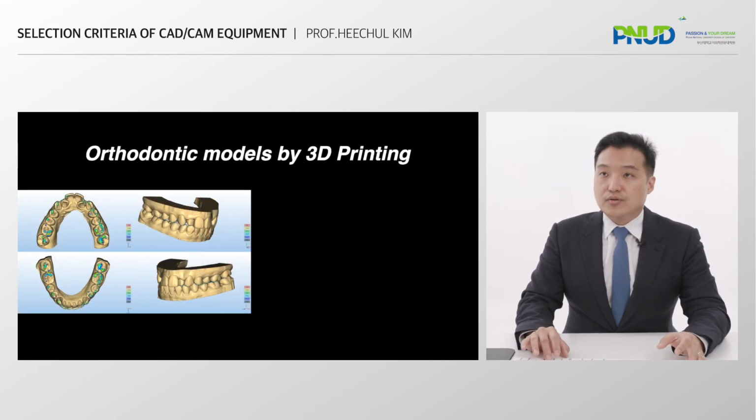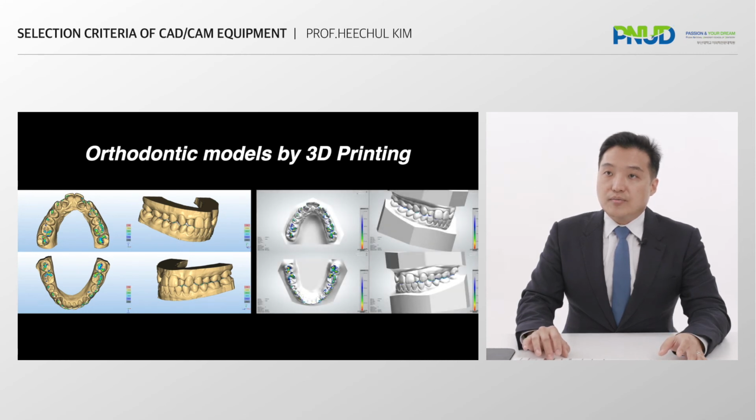These are the two most popular CAD software for digital orthodontics. The left is Maestro and the right is OrthoAnalyzer, which enables model diagnostics and the output of a stereo model for digital clear aligners. You can perform full mouth scans and also work with any scanner that allows you to export the files in STL. There has been a huge improvement in IntraScan for more accurate diagnosis and data management, easy setup models, and even digital clear aligners within the world of digital orthodontics.